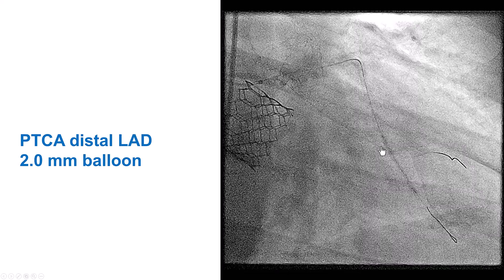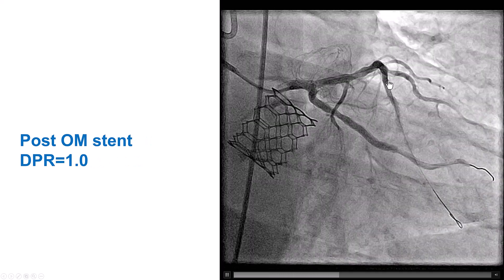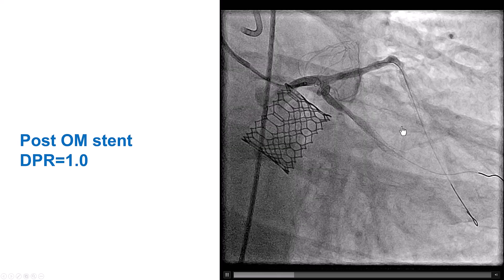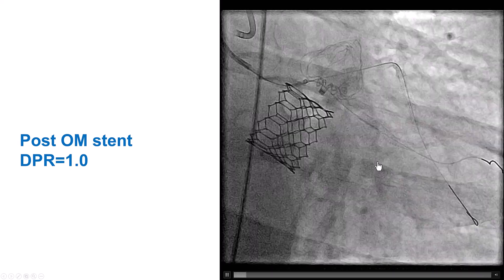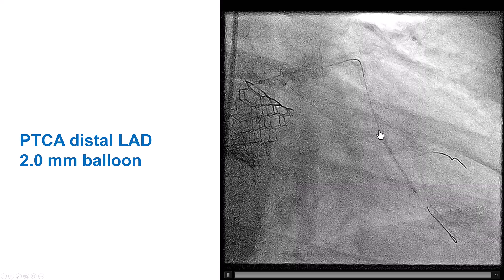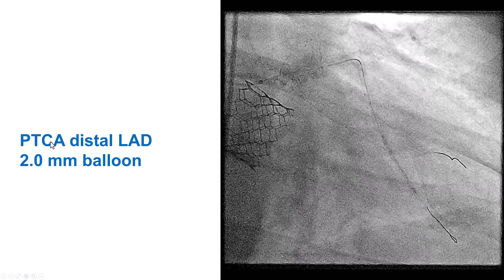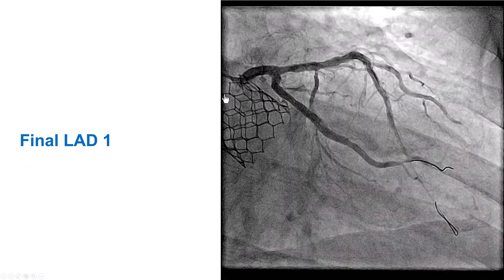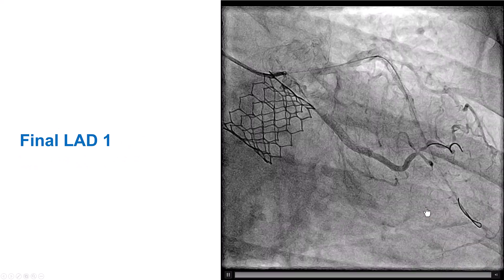The patient did have relatively poor flow into the LAD — the flow was not great despite stenting. We thought this could be due to diffuse disease in the distal vessel, so we performed additional dilations of the mid and distal LAD, distal to the previous stent, using a 2.0 mm balloon with prolonged balloon inflations. After doing that, we had much better TIMI-3 flow all the way to the distal LAD.